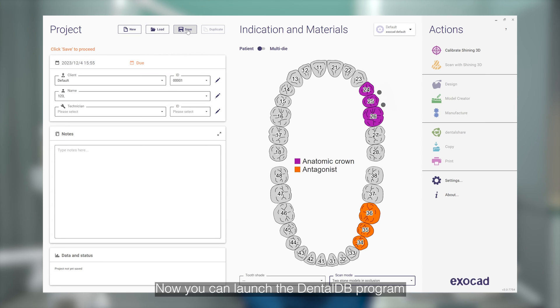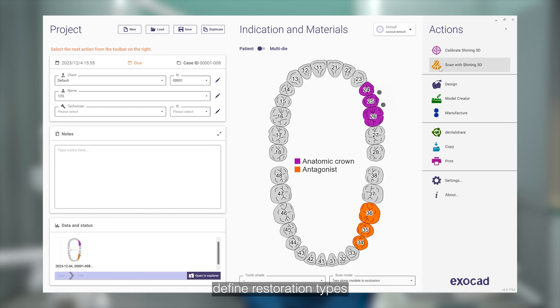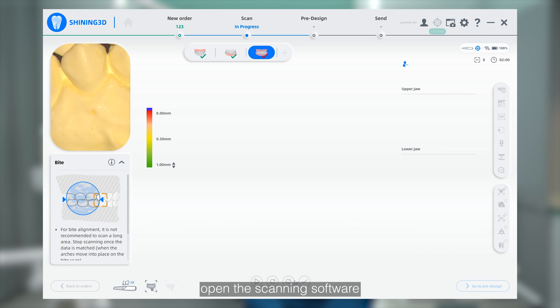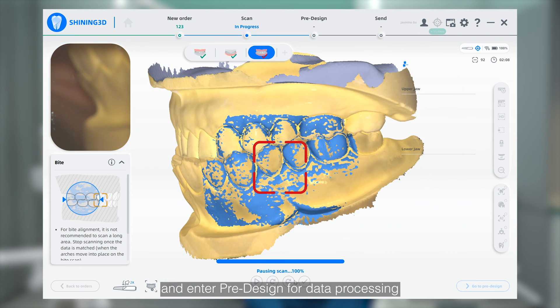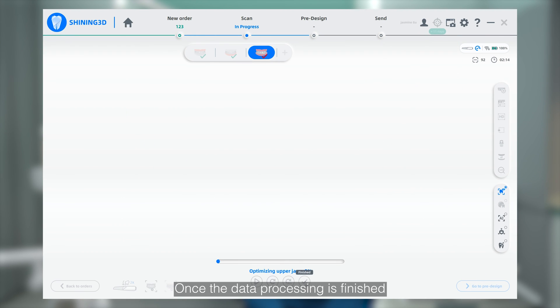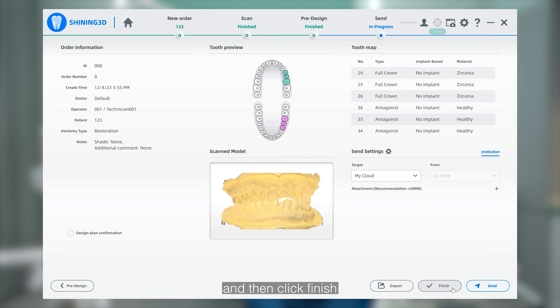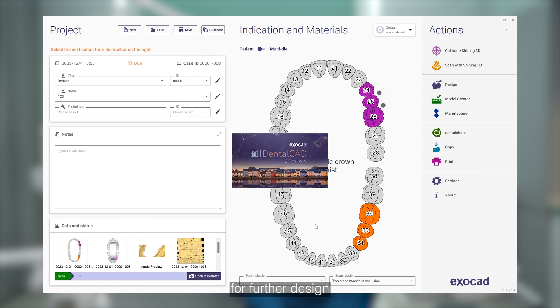Now you can launch the DentalDB program, create an order, and set the scan mode. Define the restoring types, save the settings, and proceed with scan. After completing the scan, open the scanning software and enter the pre-design for data processing. Once the data processing is finished, proceed to upload the code. Click Go to Send and then click Finish to return automatically to the ExoCAD interface for further design.